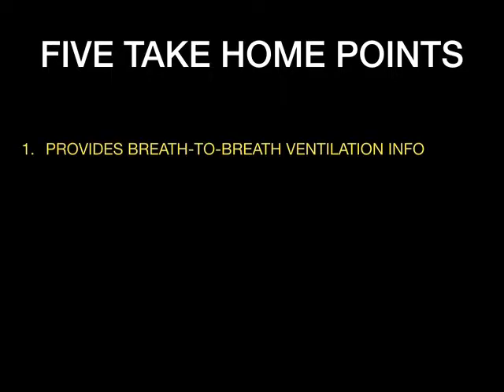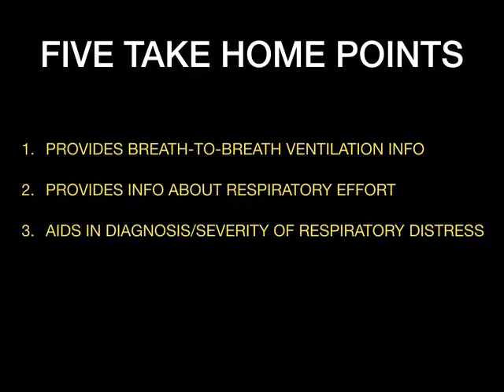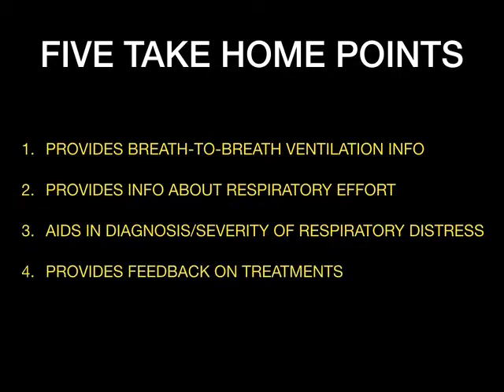Let's go back to those 5 take-home points. First, end-tidal CO2 provides breath-to-breath ventilation information, and that's really powerful. It provides information about respiratory effort. It aids in the diagnosis and severity of respiratory distress. It provides feedback on treatments. And it detects shock.